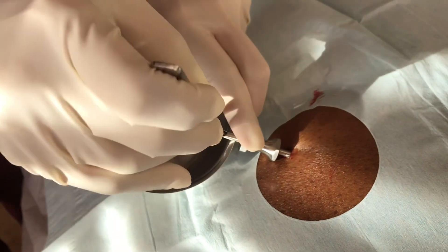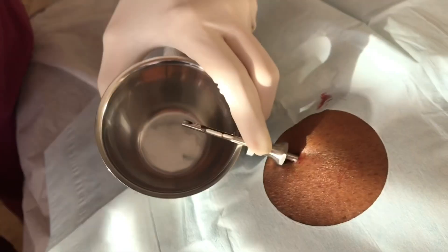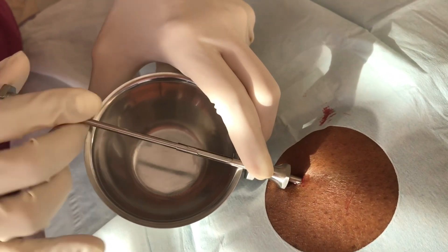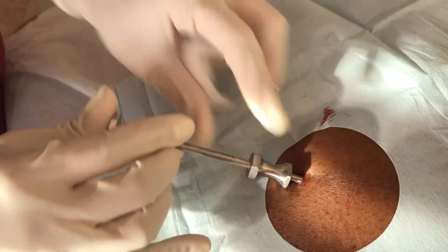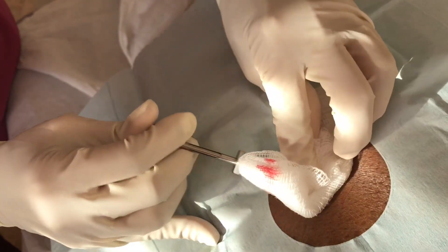Make sure that when you're pushing this in it's not in the skin nor in the muscle — you want to make sure you're in the adipose tissue. I then take the plunger, push in the pellets, and you're done.